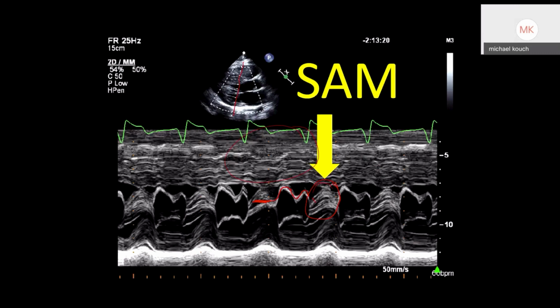And so if you have someone who's incredibly tachycardic, the heart rate's 130, right? They have evidence of cardiomyopathy here with a thickened septum. You're actually having outflow tract obstruction, and you can see the chamber of your left ventricle is completely occluded in that same location.